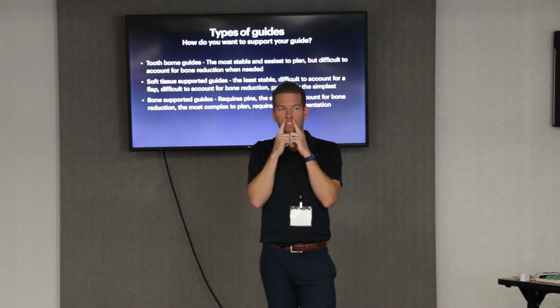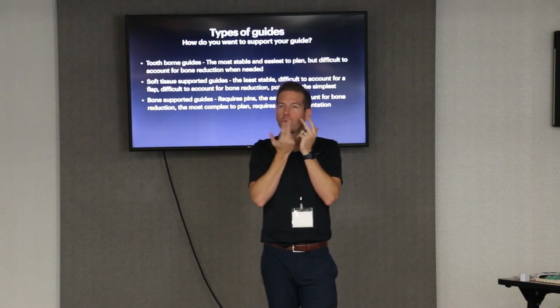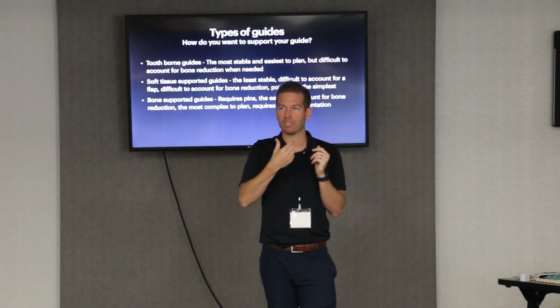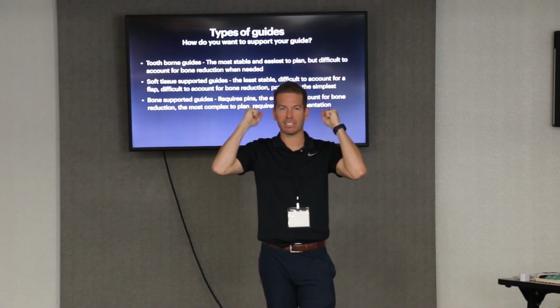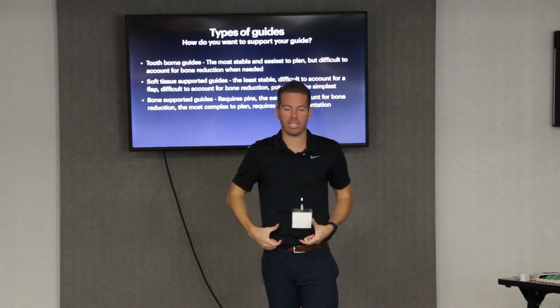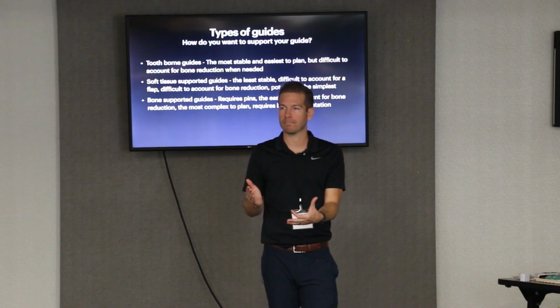But what if I pulled out all their teeth other than just the canines and the second molars, because usually you're not putting an implant in the second molar area. And now I pulled out everything in between those teeth. And then my guide just slips on to those 4 teeth. You got second molars in the back as a distal anchor. You got big canines as a front anchor. Now this thing just clicks onto the 4 teeth, and now you just place your implants in between.